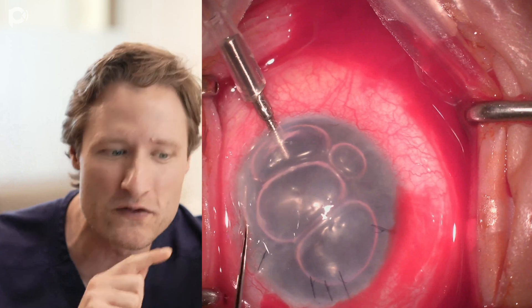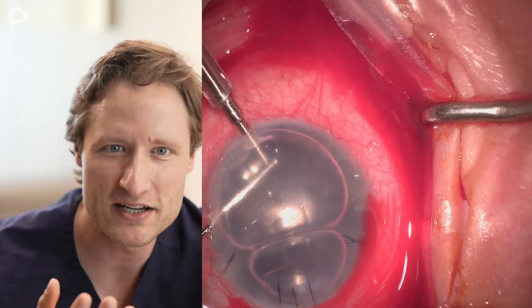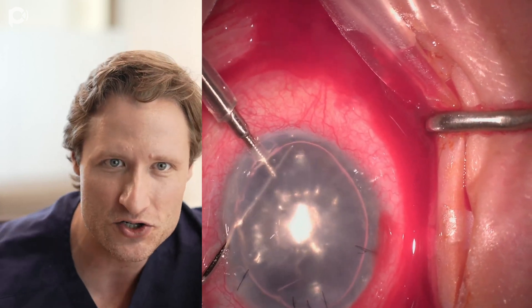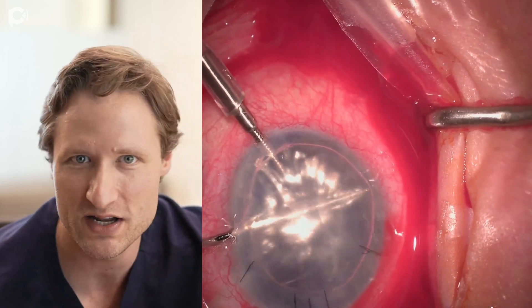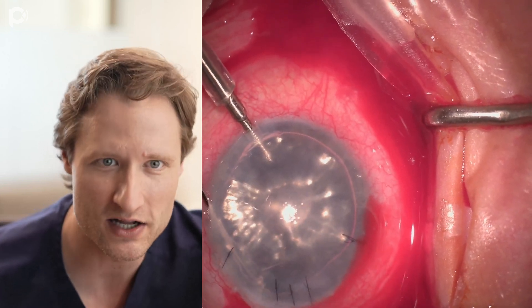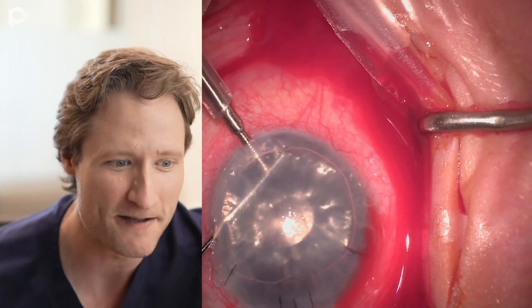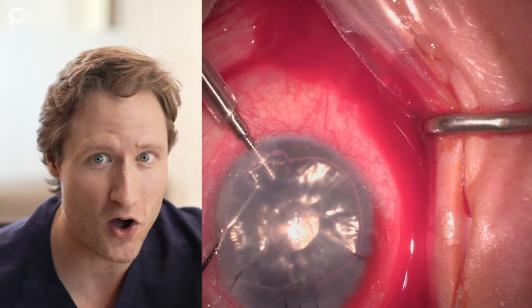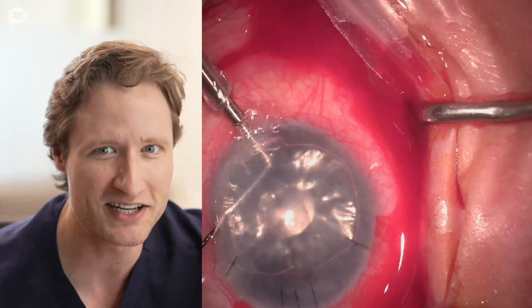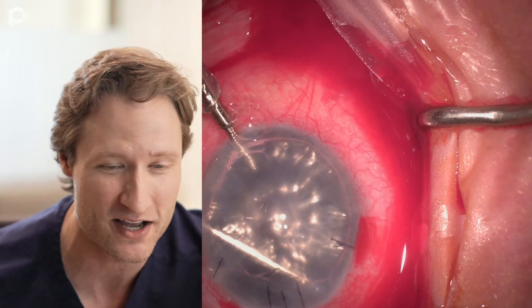After we've removed the graft, what I'm doing now is going around trying to find unstripped little shred remnants of native Descemet's membrane so I can clear them completely before putting a new graft in the eye. This is, by far, the longest part of the surgery, and I'm not going to edit it. I'm going to let it play because I think it's important to watch all of these details.